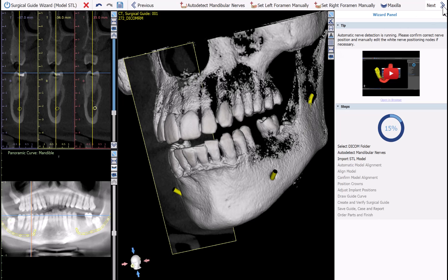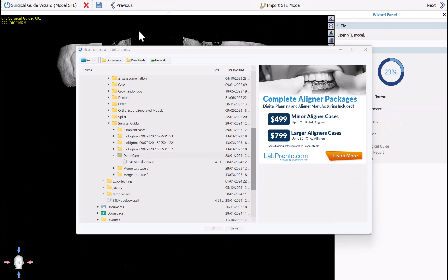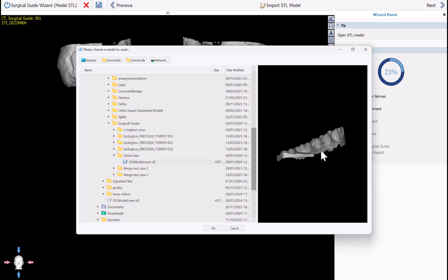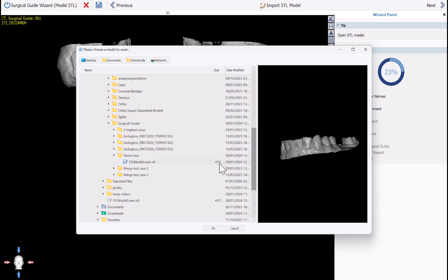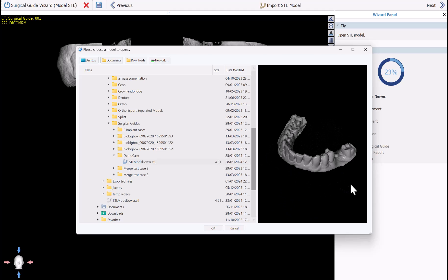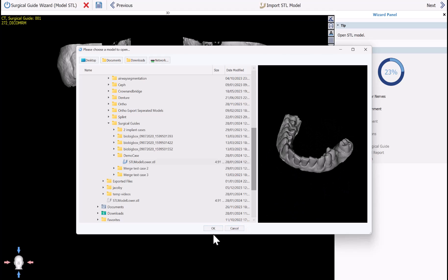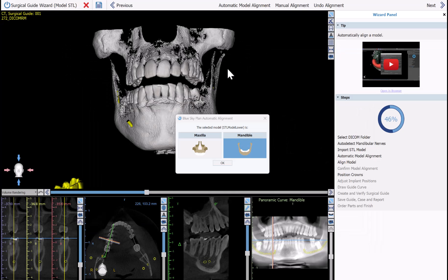The software is now prompting us to select the relevant optical scan. Go ahead and left-click on that — you can see a preview on the right side of the screen — then click OK. This is a mandibular case, so we're going to select Mandible and click OK.